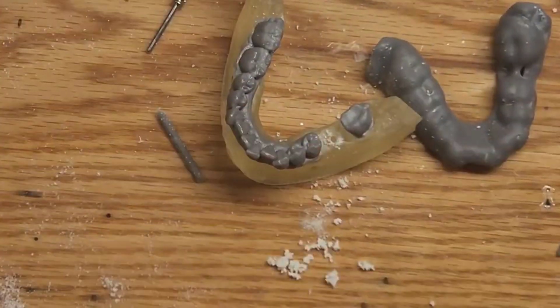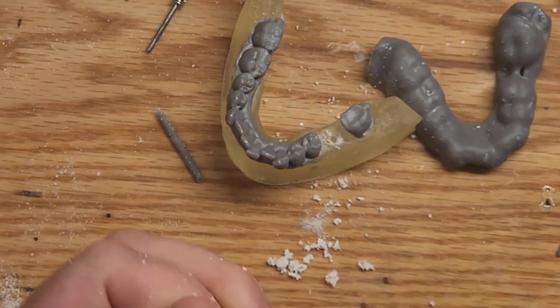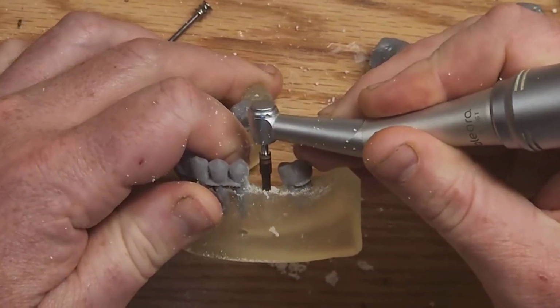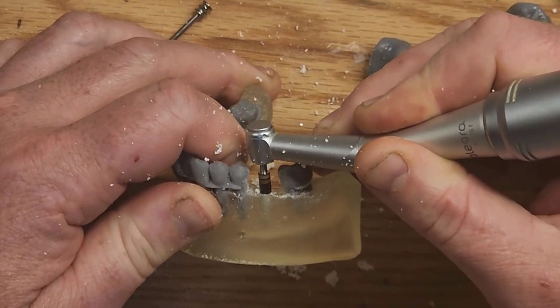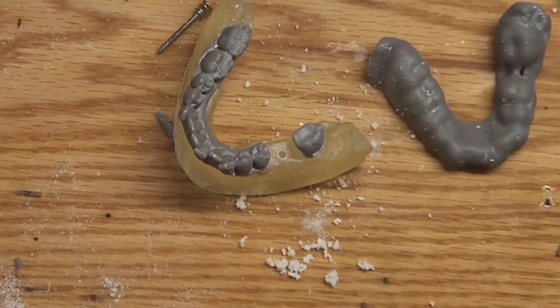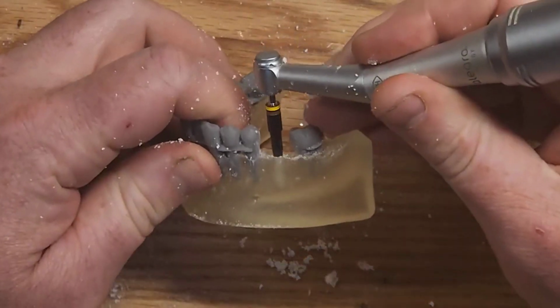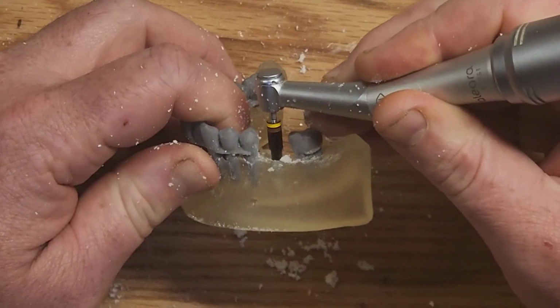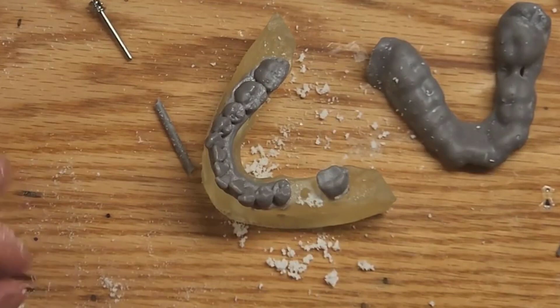And we could just go all the way up in our drill sequence. And I think this called for like a 5.0 implant. But as you can see, it's not going to be a problem to drill on this.